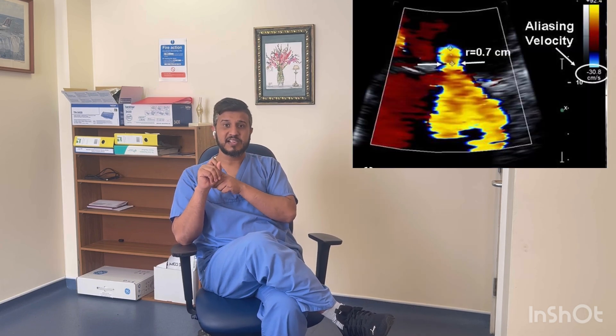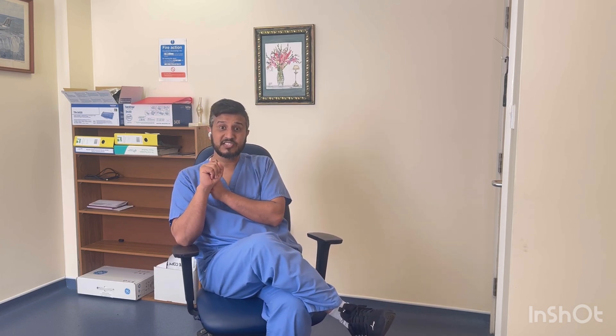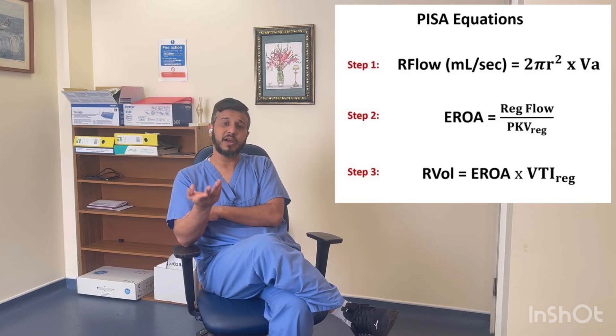When doing the PISA method, the machine mainly asks for three things: first, the aliasing velocity — some machines pick it automatically, others ask you to enter it, and some just ask you to select upper or lower aliasing velocity. Second, you trace the VTI of the regurgitation jet using CW Doppler. Third, you measure the PISA radius. Once all three measurements are done, the machine gives you both the ERO and the regurgitation volume — it calculates ERO first, then multiplies by VTI.